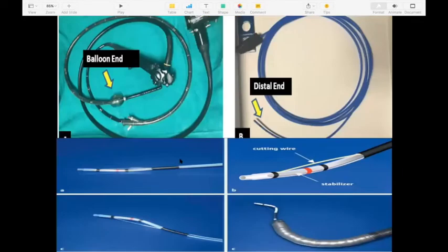So these are the standard single balloon endoscope. You can see the endoscope. So I usually use an APC, the old APC probe, which has a forward viewing or forward facing opening, not a lateral facing one. And this I use because the length is more than 300 centimeters. So I usually use this or a bile cannula.